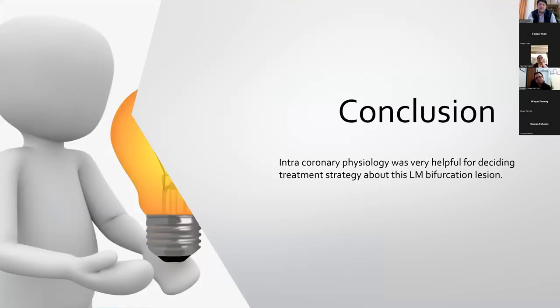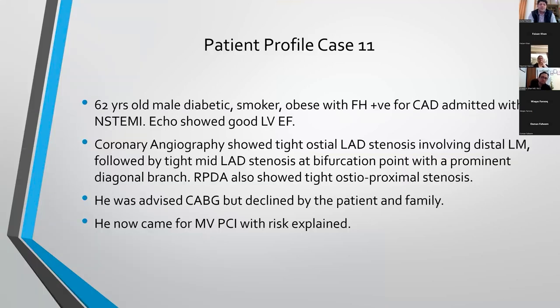Intracoronary physiology was very helpful for deciding treatment strategy for this left main bifurcation lesion. My next patient is a 62-year-old male, known diabetic, smoker, obese, with family history positive for CAD, admitted with non-ST elevation MI. Echo showed good LVEF.